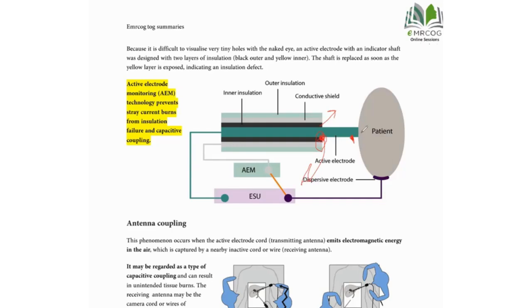You are working here. This is where you are doing the hemostasis, for example. If you have insulation failure, it can happen here, or here, or here, but not very above. If it happened very above, you are very unlucky, okay? You are not going to detect it unless the maintenance people do some tests for the electrode and figure out that there is insulation failure. It's not capacitive coupling, it's insulation failure.